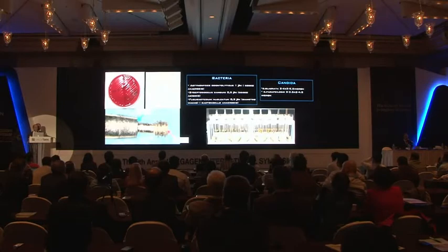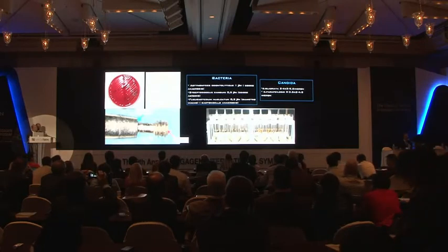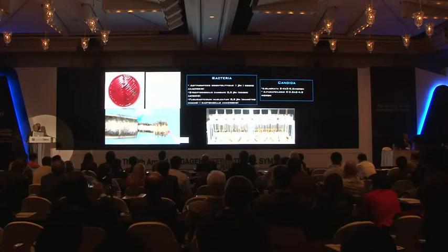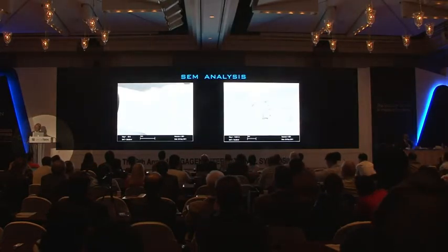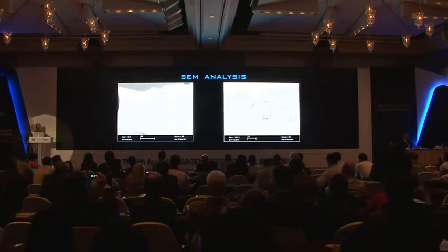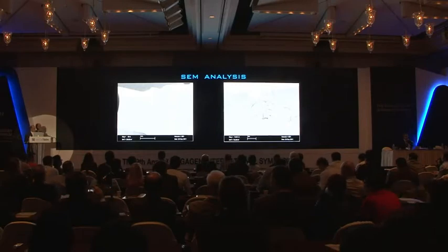After 15 days, we removed the abutment and performed 2 swabs, one in the connection and the other in the screw, to check for the presence of microinfiltration. We also performed a SEM analysis in order to visualize the presence of microorganisms organized like a biofilm. You can see a biofilm organized on the right.